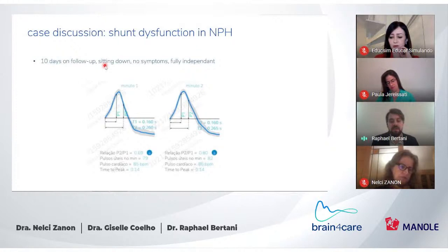We had him in quiet laying down, and we were able to do this. And when he came back, he was already so much better that he could already sit down, and we could do the full exam with him sitting down, with full monitoring, and it showed absolutely normal values.